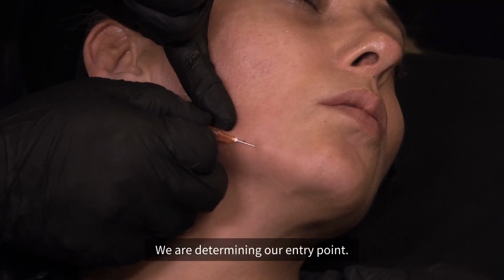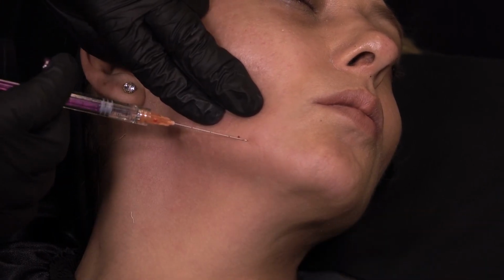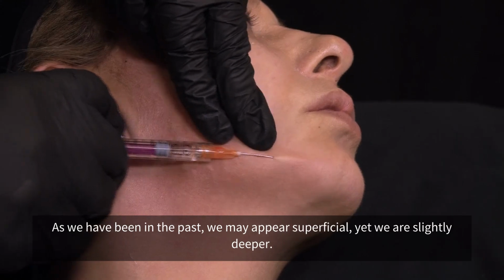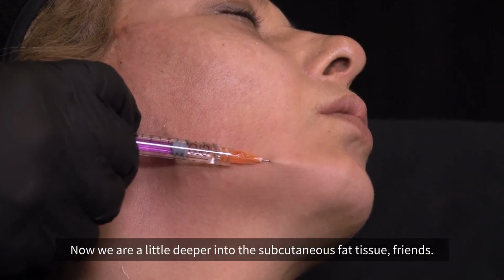We are determining our entry point. We are in the pre-jaw area. No deep injection is available again. As we have been in the past, we may appear superficial, yet we are slightly deeper. Now we are a little deeper into the subcutaneous fat tissue, friends.